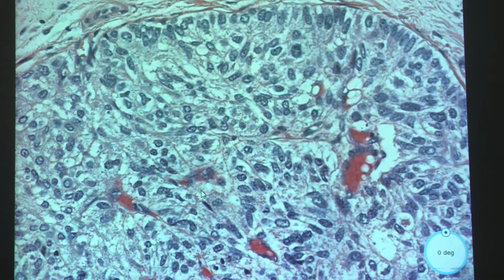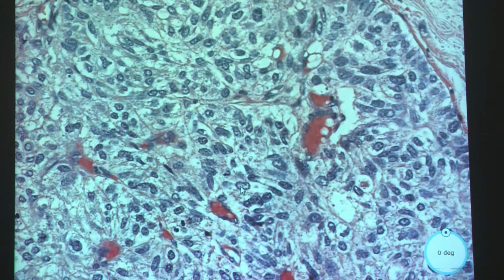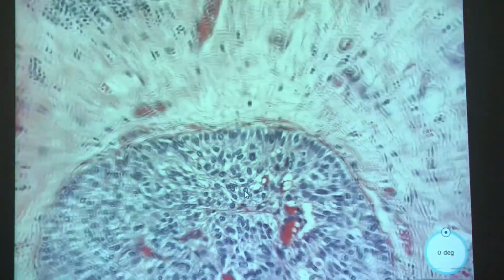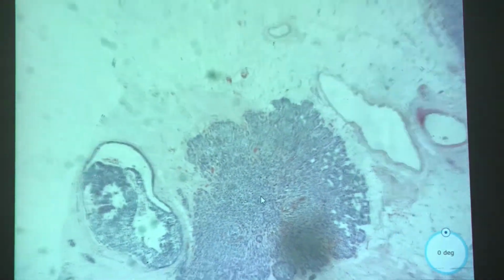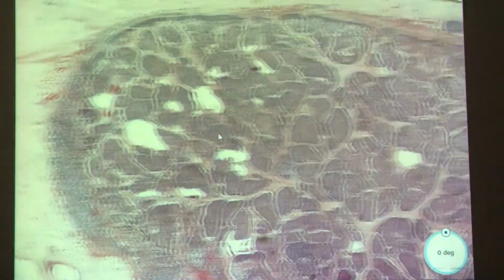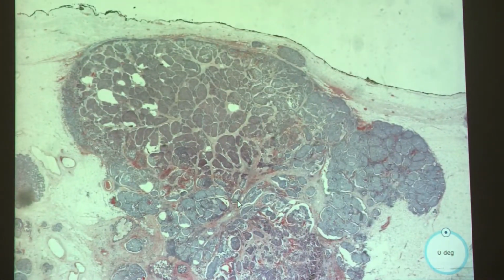But solid papillary carcinoma is also known as neuroendocrine DCIS. So sometimes it can look like a neuroendocrine tumor, but a little smaller. It can have spindle cell type as well, so this might be just a little more spindle than neuroendocrine.